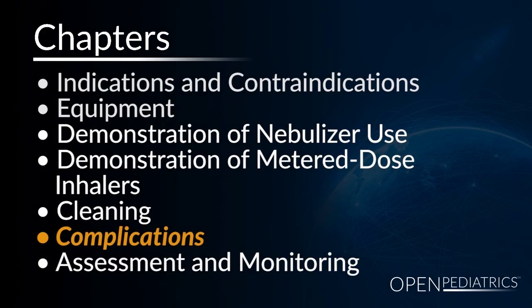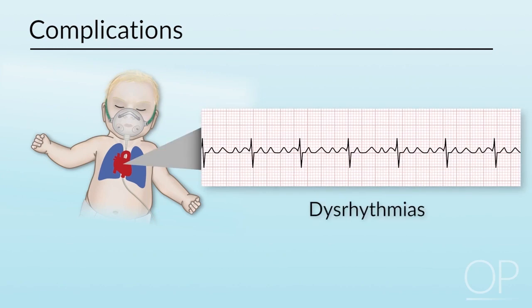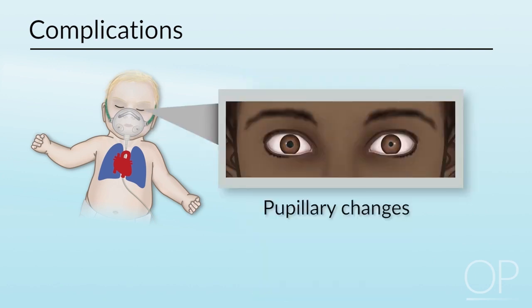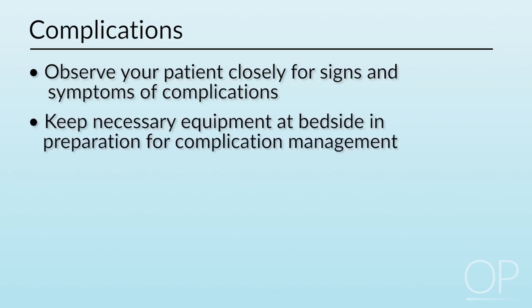Complications. The complications that you may observe include tachycardia or dysrhythmias, no improvement in breathing pattern or gas exchange, oral candidiasis or pupillary changes with certain administered medications. I encourage you to monitor your patient closely for signs and symptoms of complications and to be prepared to manage them. This includes having the necessary equipment available to treat the complications should any arise.